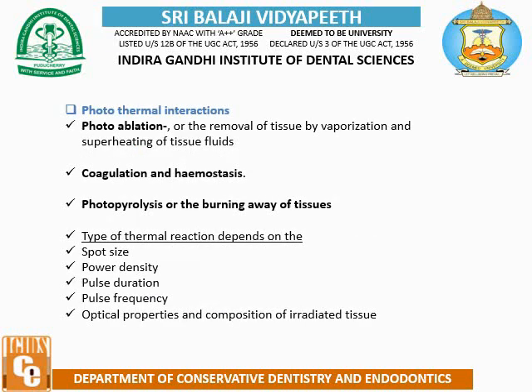Photothermal interaction: photoablation or removal of the tissue by vaporization and superheating of the tissue fluids, coagulation and hemostasis, photopyrolysis or the burning away of the tissues. Type of thermal reaction depends on spot size, power density, pulse duration, pulse frequency, optic property and composition of irradiated tissue.